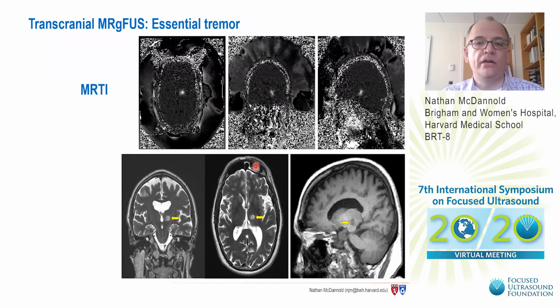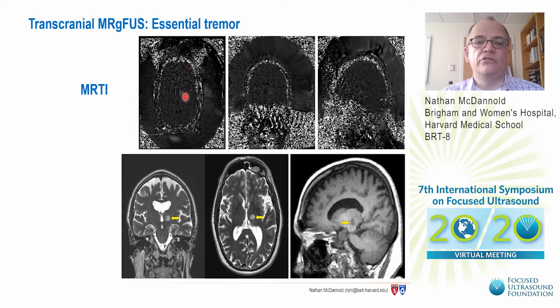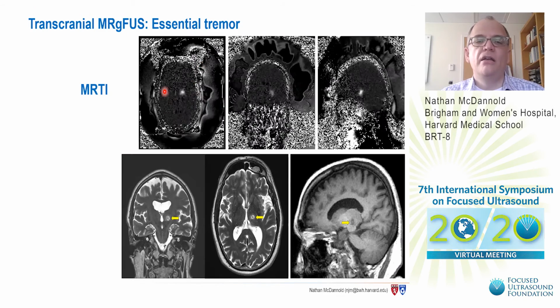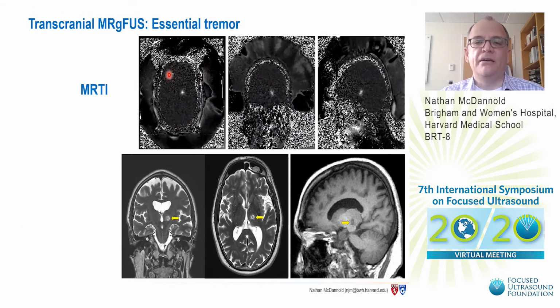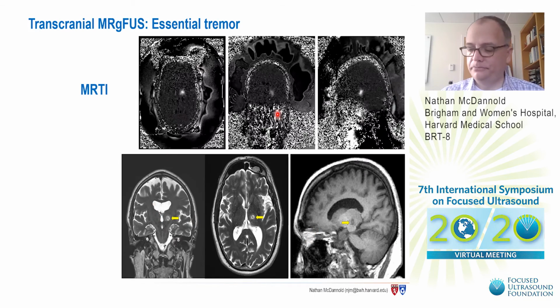During the procedure, we acquire temperature images that we use to localize the heating and to quantify the temperature. And this is 3 examples from one case. We can see the lesion that's produced. This is 24 hours later.